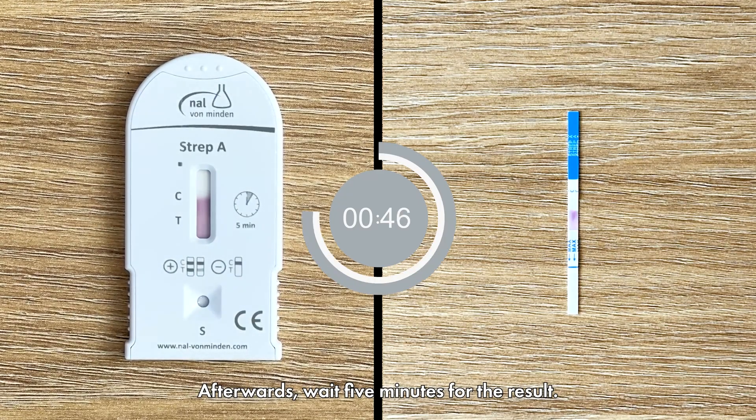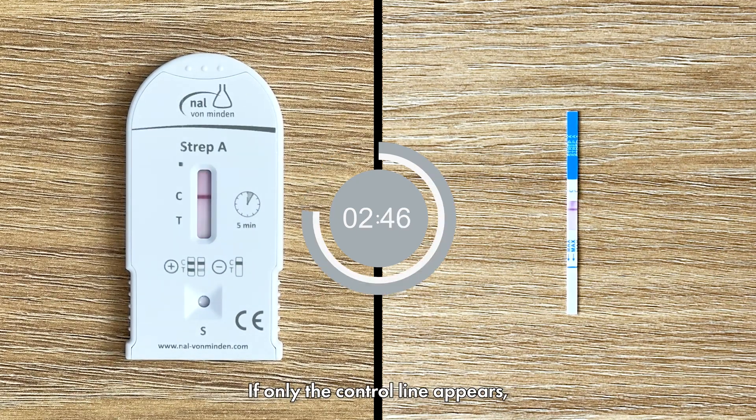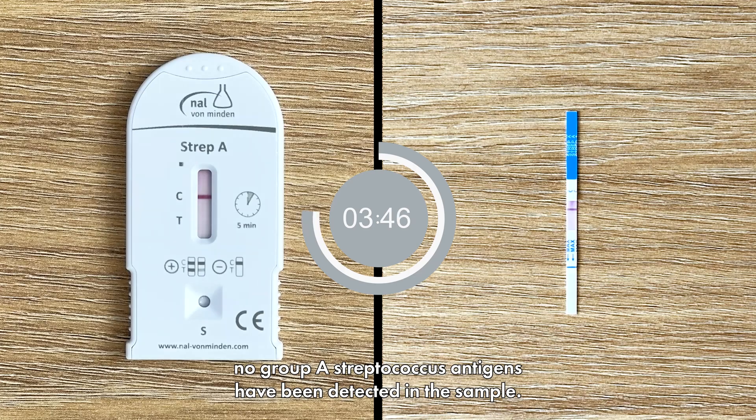Afterwards, wait 5 minutes for the result. If only the control line appears, no Group A streptococcus antigens have been detected in the sample.